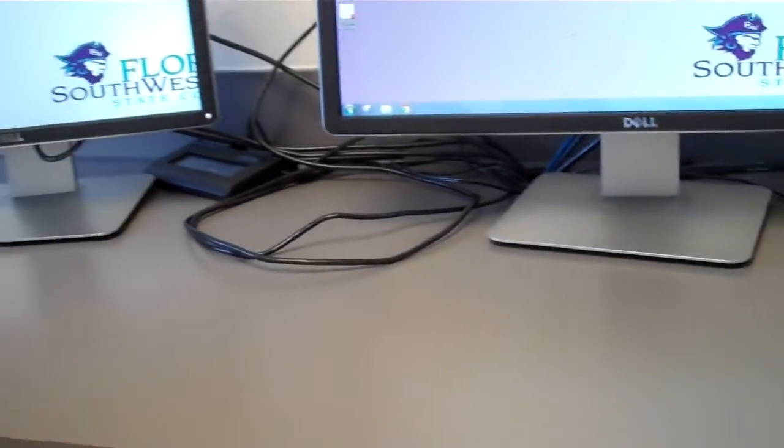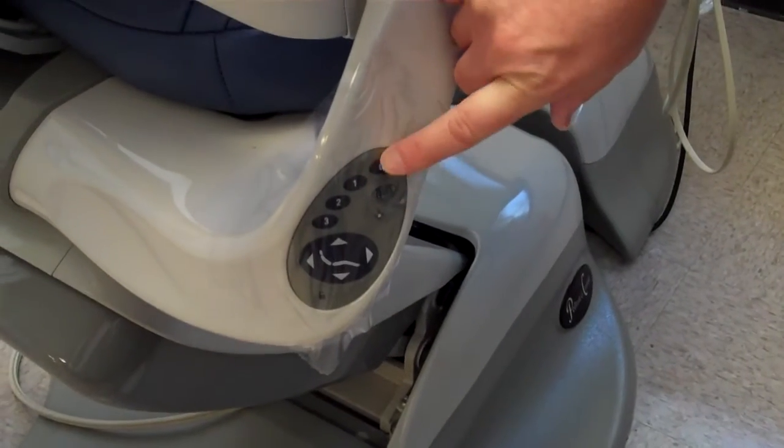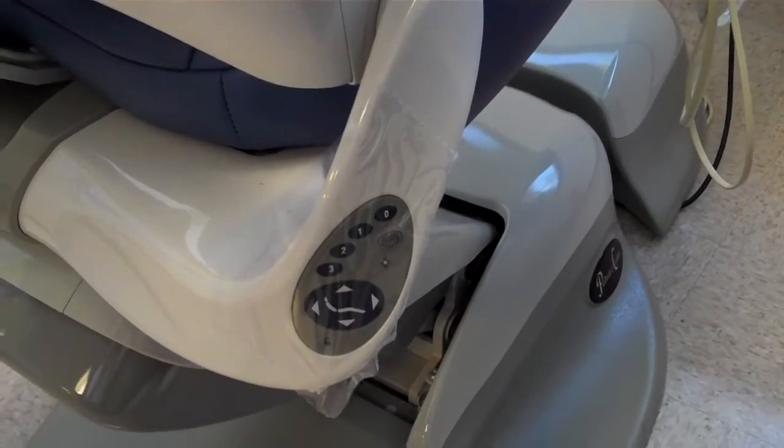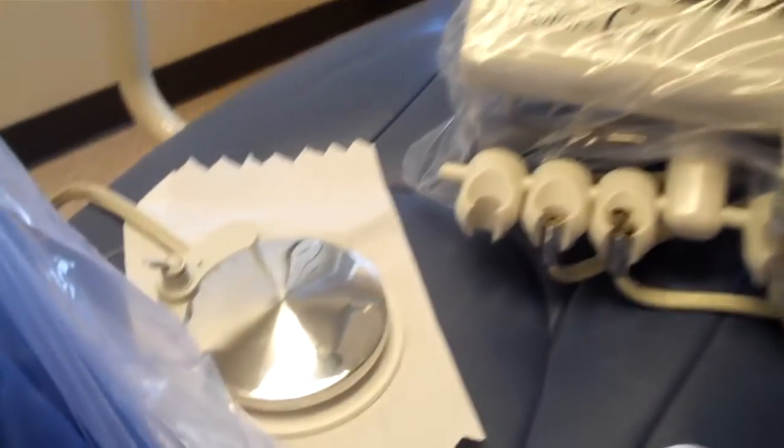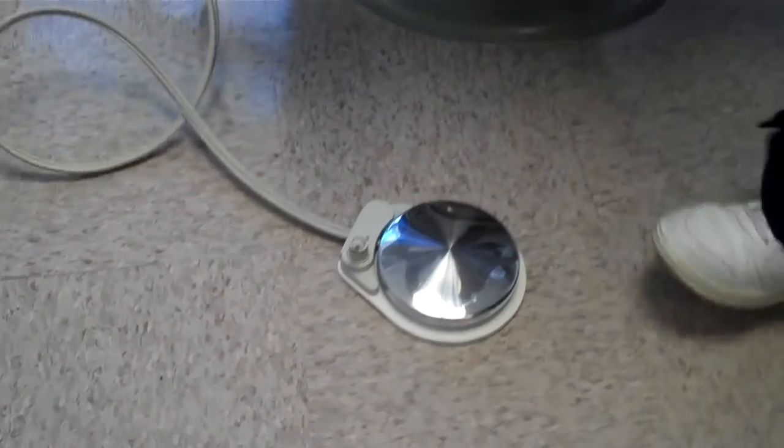The next thing you're going to do is hit the unlock button and then zero. That will bring the chair down. There is a rheostat on top of the chair which is covered by paper toweling. You'll take that off and place it directly on the floor, and place your paper toweling in the trash receptacle.